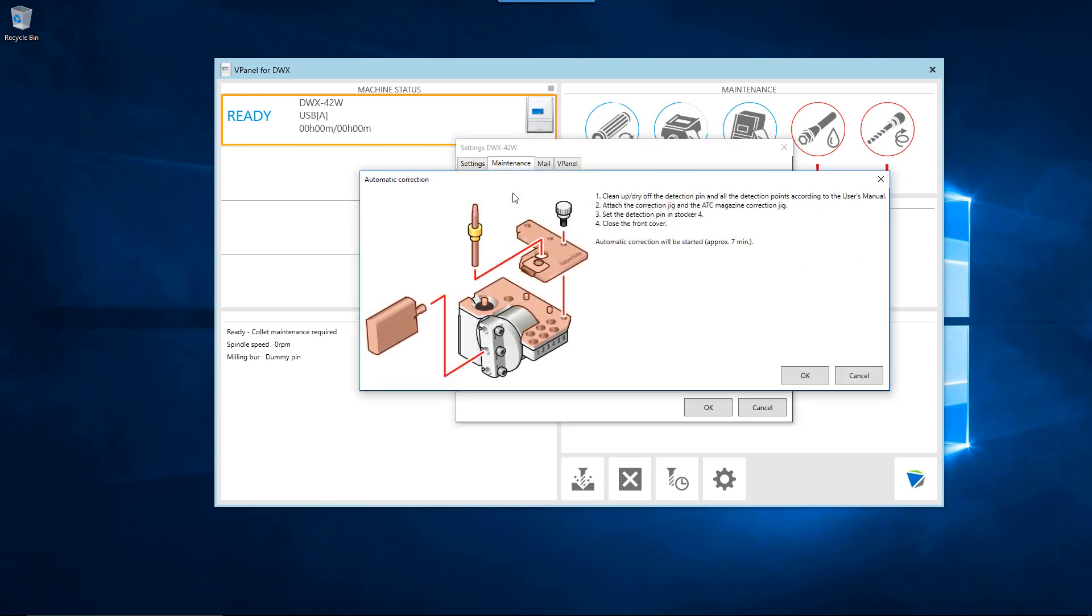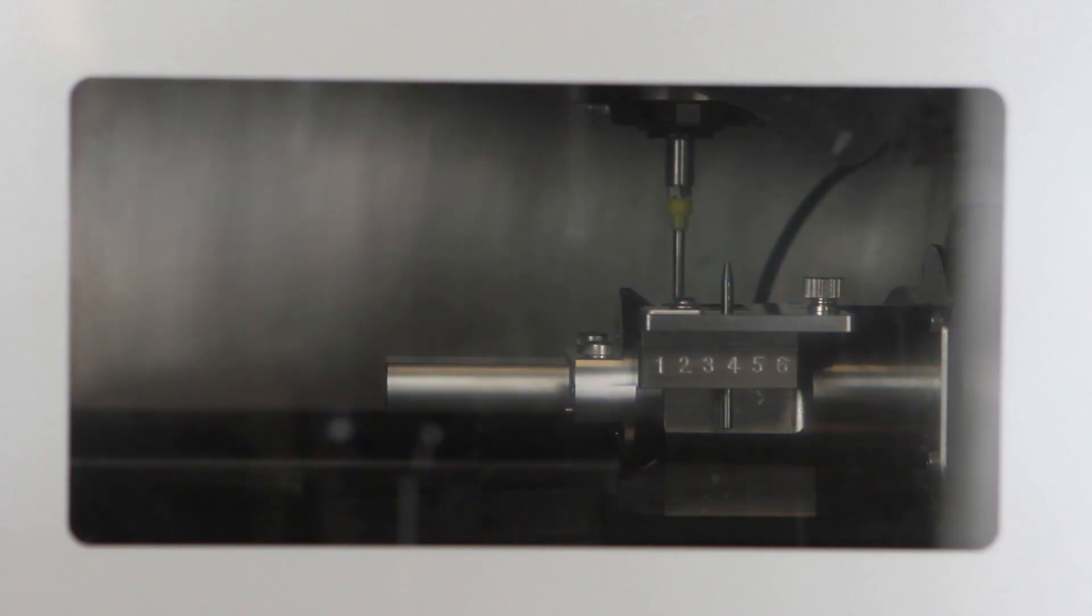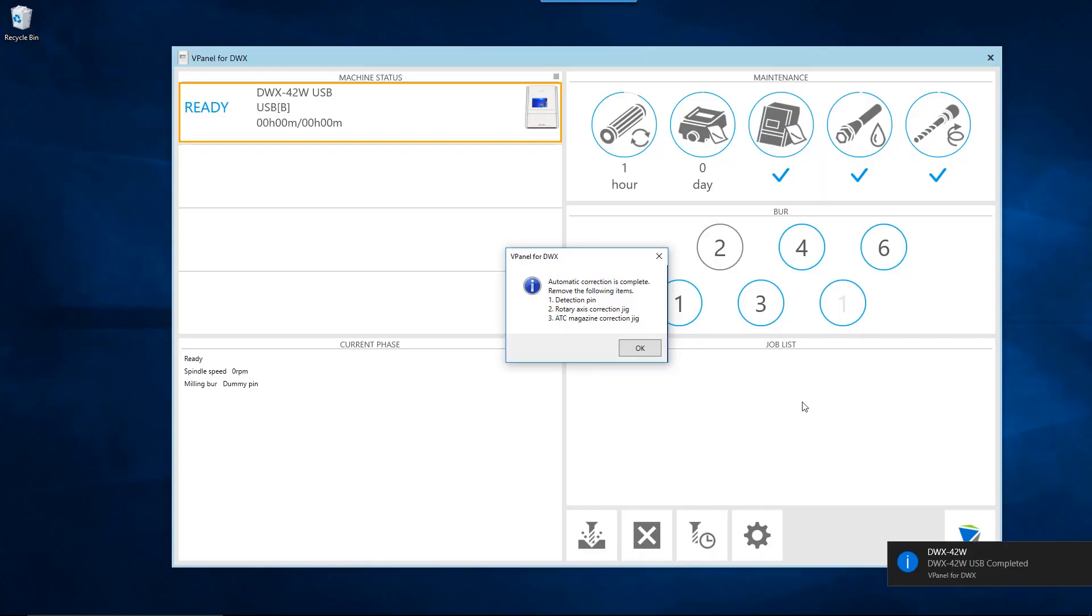Click the OK button when you have confirmed that all work pieces have been removed from the mounting part and both correction jigs are set up properly. Once the operation is completed, click the OK button to close the vPanel pop-up and complete the automatic correction procedure.